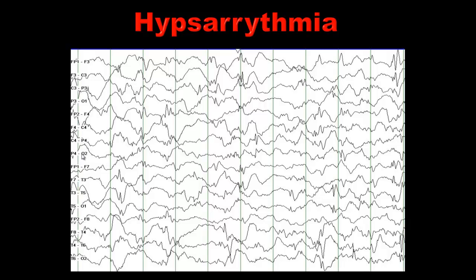Hypsarrhythmia is basically a disorganized pattern. In a normal EEG, you can tell whether activity is from anterior or posterior leads, but in a hypsarrhythmic EEG, it is disorganized — you cannot state the anterior or posterior pattern. The second feature is high amplitude slowing: you see a lot of delta activity, some superimposed beta frequencies, and some theta frequencies. So it's a high amplitude, disorganized EEG with multifocal sharp waves — one sharp wave in F3, then another in Fp2. Multifocal means in three or more non-contiguous separated areas. This pattern can be associated with infantile spasms.